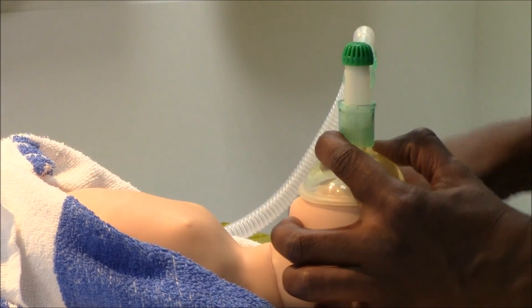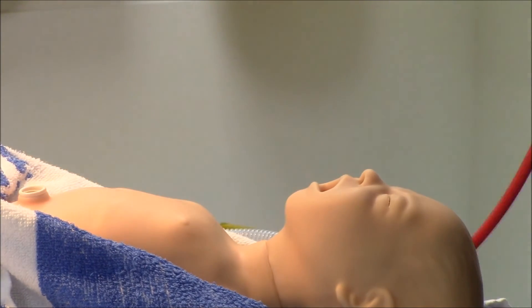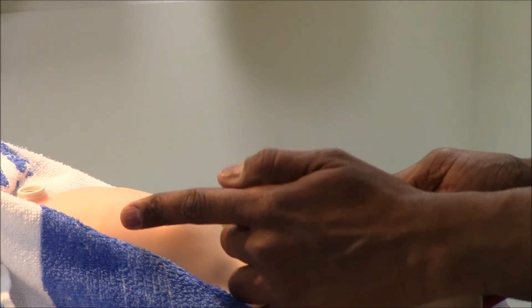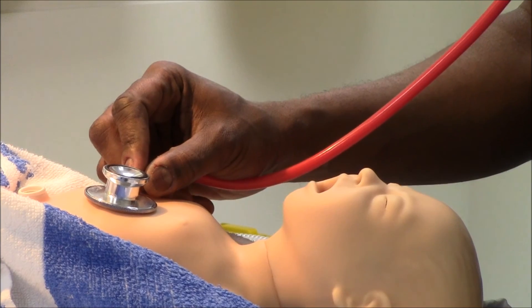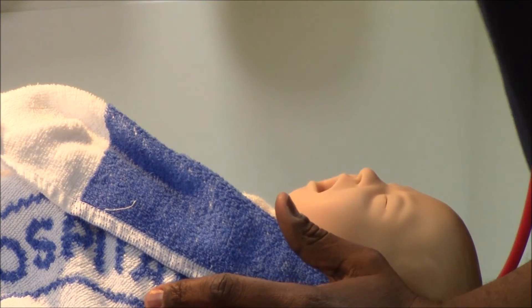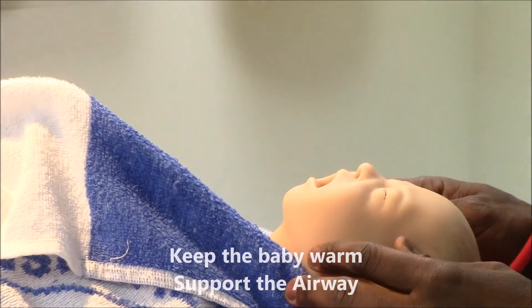I hope there is some help coming. I will do this for 30 seconds and at the end of 30 seconds I am going to reassess the baby again. I am going to check and see if the baby is crying — you can see it is breathing actually, it is starting to cry now. I will keep it warm, support the airway and observe a little bit longer.